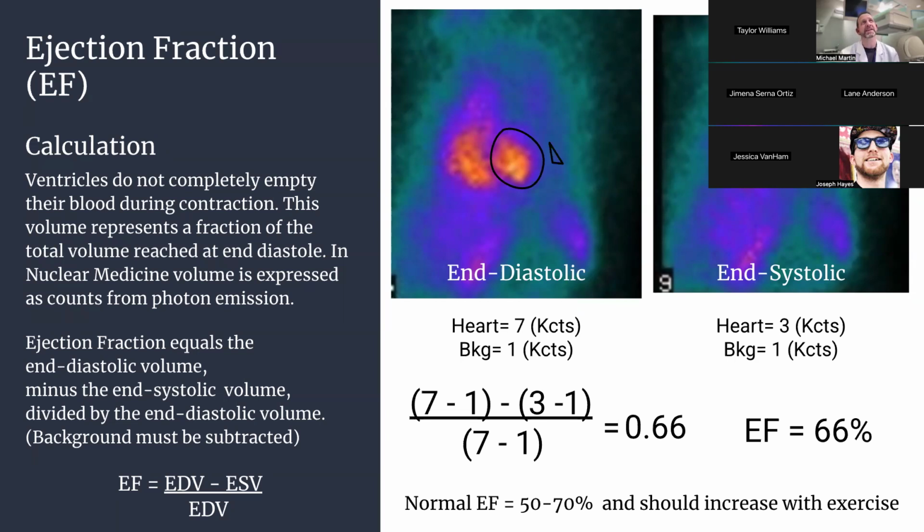The only caveat I might give to that is, well, I've never tried it, but I would question turning the camera. It depends on your smart zoom. Some smart zooms, if I was looking at my camera head here, the septa are all running like this, and then they're pointed in. On some smart zooms, it's more like a pyramid, so you have septa on all four sides pointing in, or you have circles that are angled in to a central point. So some of that could depend on what type of smart zoom you have. If it's the one where it's just the lines, you're probably good, because as you rotate and try to get that septal wall, it probably wouldn't cause any problem at all. You might run into problems with the other configurations. I'm not sure. It's a good question though, but you should be able to use it. If nothing else, try it.